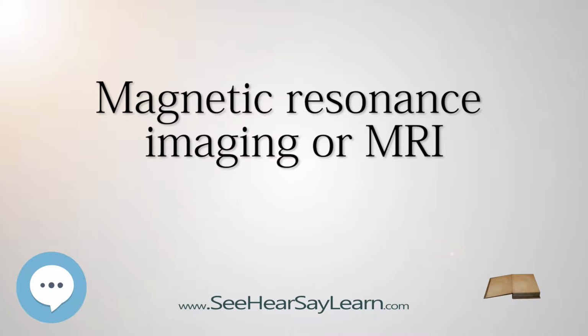MRI was originally called NMRI, Nuclear Magnetic Resonance Imaging. It is based upon the science of nuclear magnetic resonance, NMR. Certain atomic nuclei are able to absorb and emit radio frequency energy when placed in an external magnetic field. In clinical and research MRI, hydrogen atoms are most often used to generate a detectable radio frequency signal that is received by antennas in close proximity to the anatomy being examined.